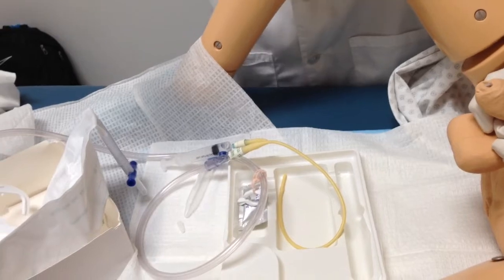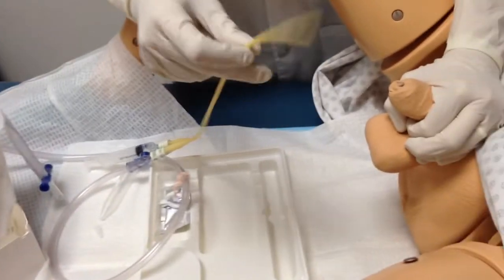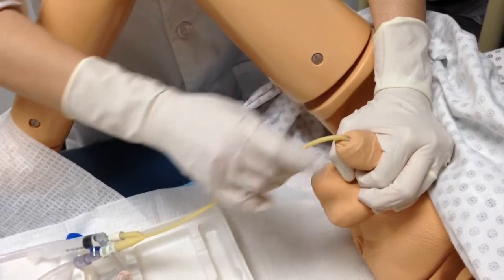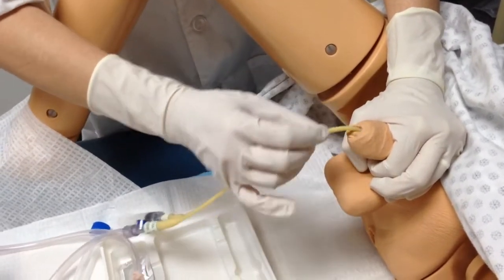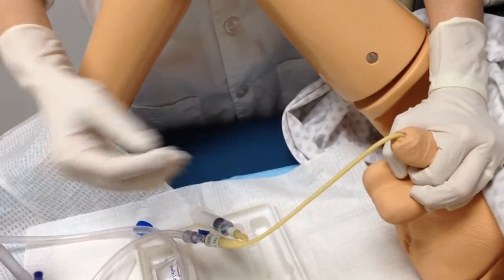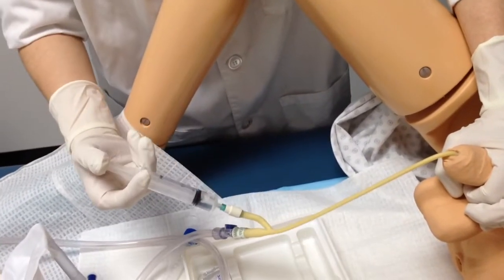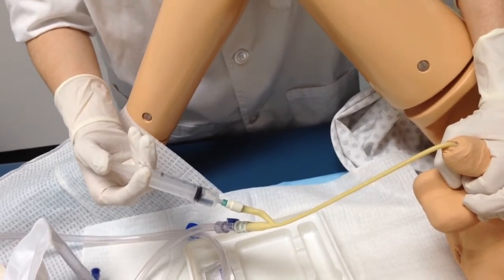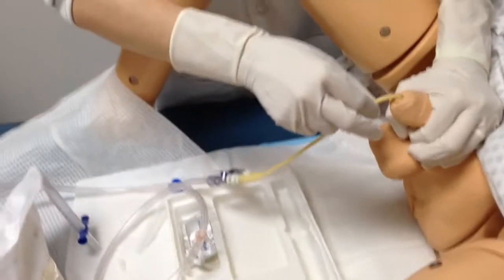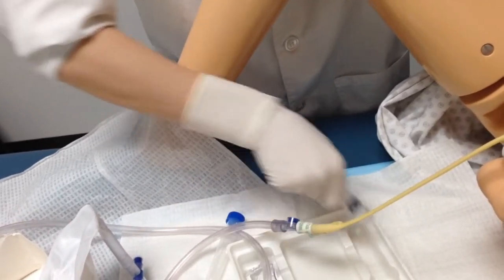Now from here, we're ready to insert the catheter. So Mr. Jones, you're going to feel a little bit of discomfort and slight pressure, just so you know, so don't be alarmed. Alright, so from here I'm going to insert the catheter until I begin to see urine build up into the tube. After I see urine start to fill into the tube, I'm going to place the catheter in about another 1 to 2 inches. And then from here I'm going to insert the solution to blow up the balloon. So we'd insert the solution, about 10 cc's. And then I'm going to tug on the catheter, make sure that it's inserted properly. And then I can remove the syringe.